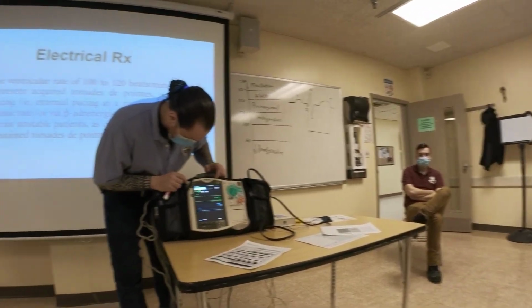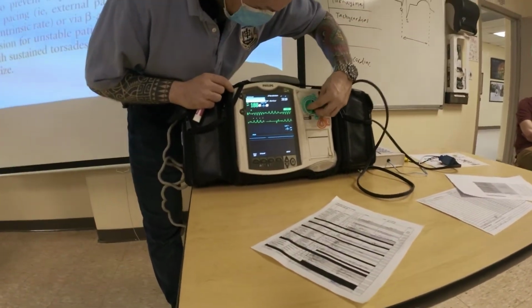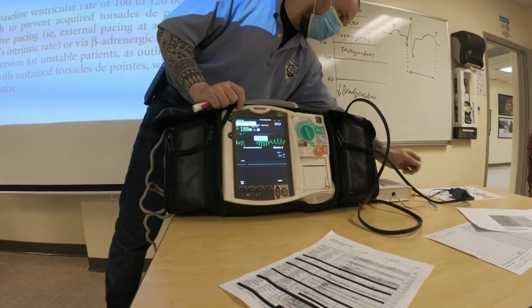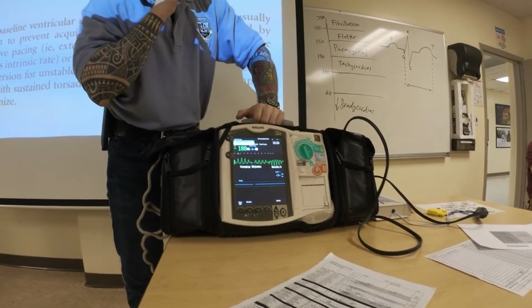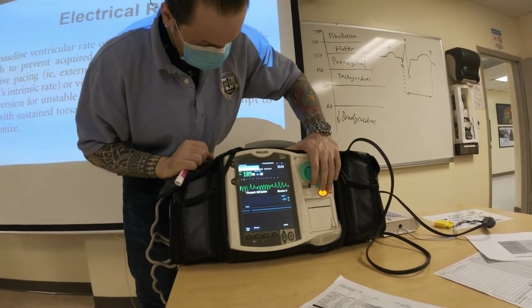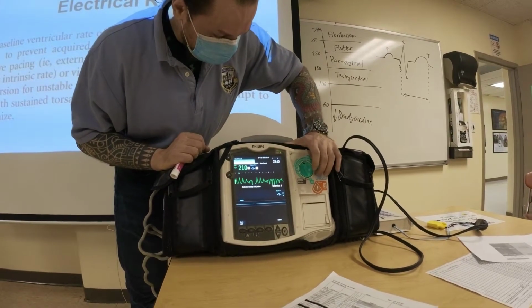So I put the torsades in here, and then let's put sync. Let's see if it syncs. Because sometimes what happens is, if it doesn't sense the R waves, it will not deliver the shock. So this sensed it here, it was able to, but some machines cannot.